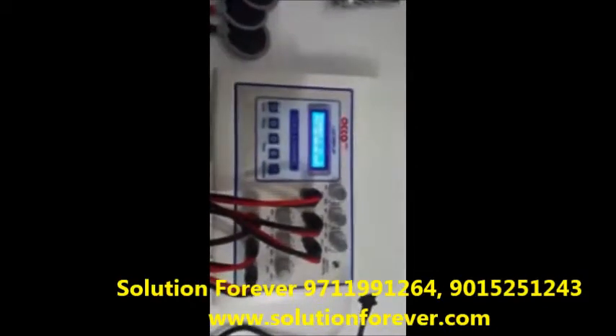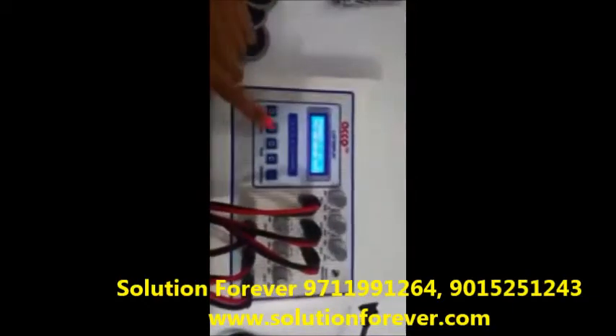Before setting all the parameters, make intensity knobs at 0. Now set the program as per unit.